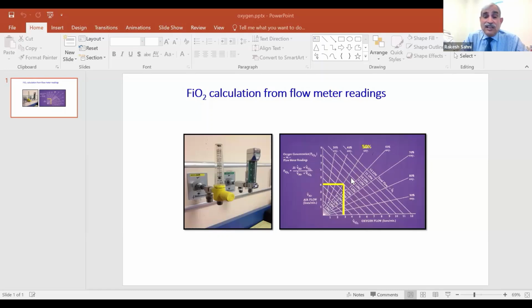So this is an easy way of, I think the Venturi ones, I'm glad I saw that. I saw that somebody was developing that, had approached us to look at it, and they had very high precision at high oxygen ends. And it's an old concept we learned in medical school, how you can change the mask oxygen when you're giving oxygen by the Venturi effect. That would be the cheaper option for the future. But in the meantime, if you have a flow meter, you can basically precisely control the oxygen.